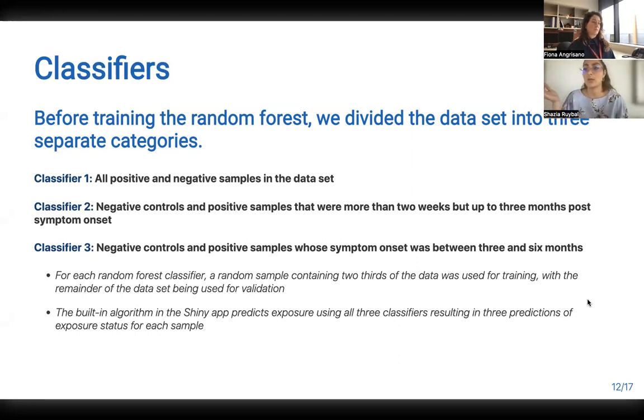I think these are things that we need to be discussing together as we start processing more samples and start to discuss which classifier may be the best. We have had instances where certain samples are considered positive by one classifier and not the other, and that happens because we know that the sensitivity and specificity is not perfect. So that's where I think it's worthwhile to have discussions on how to interpret data when we have those specific cases.